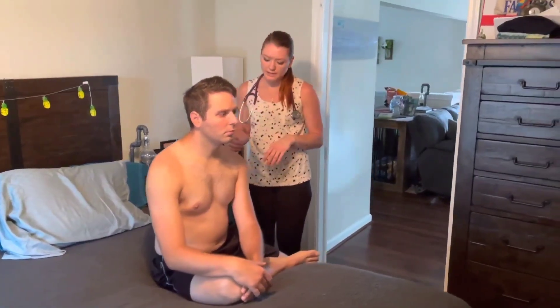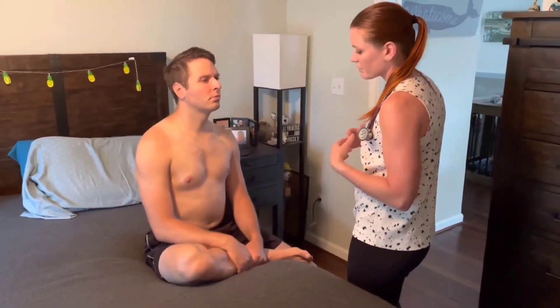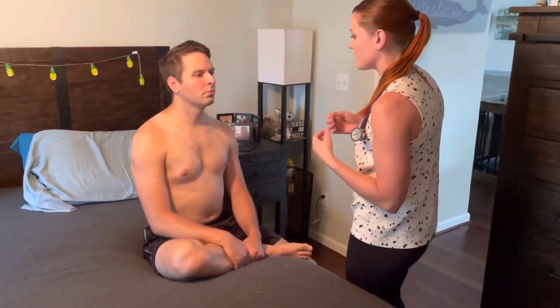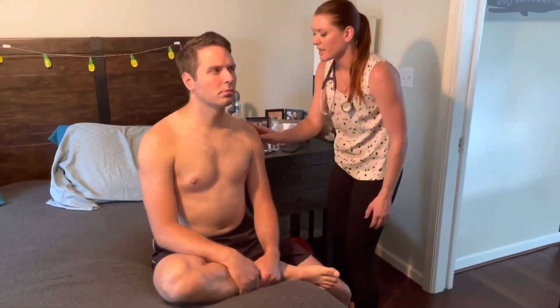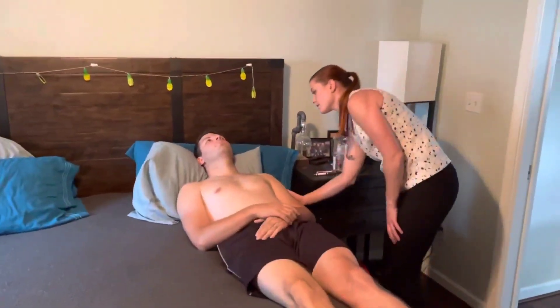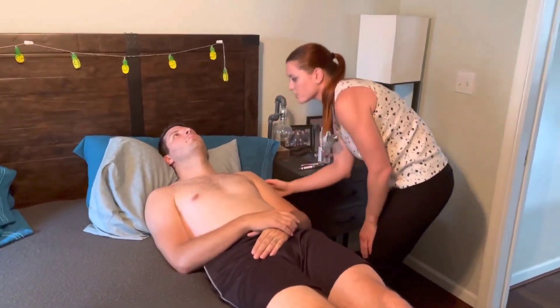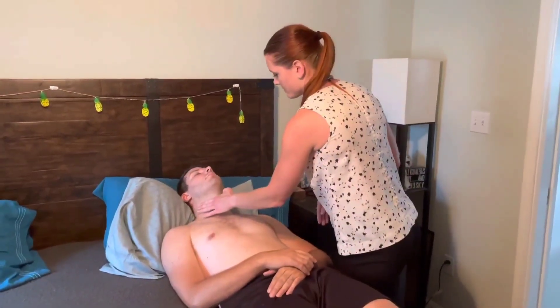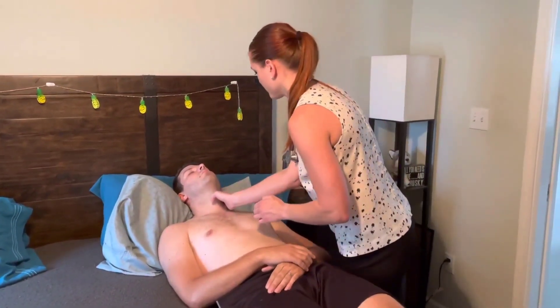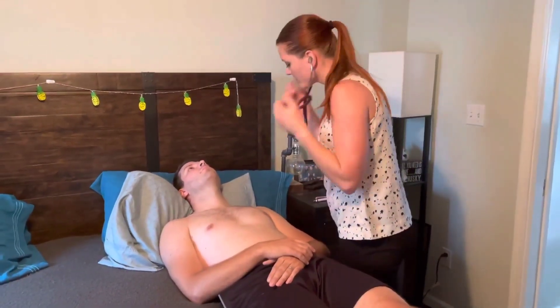Moving on to the cardiac system — facing front, looking for any signs of pulsatile mass or scarring from surgery. Looking at the jugular venous distension — no jugular venous distension is noted. Checking the carotid, one at a time. Checking for any bruits with the bell — no bruits were noted.